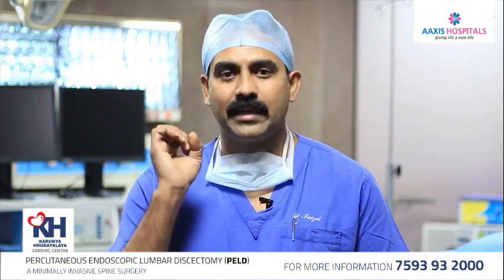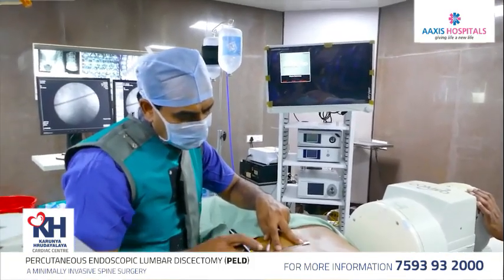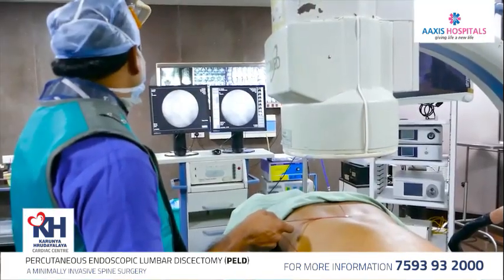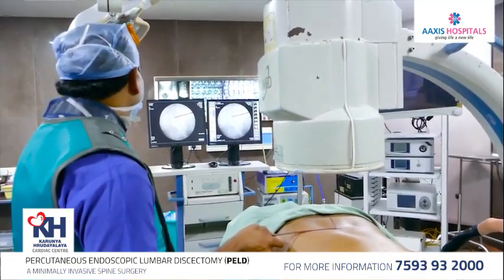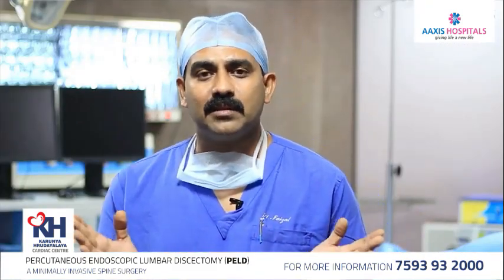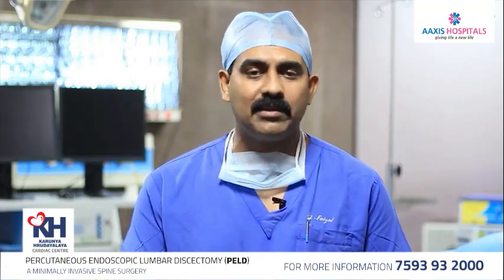So we give a small local anesthesia into the skin, and get into the disc by way of needles, guide wires, cannulas. Once we are in the disc, we confirm that we are dealing with the right disc as confirmed by the MRI or previous examination. We confirm that we are in the disc by giving a small injection of radio-opaque dye. We confirm the position. Then we start the surgery by introducing the scope. The procedure may last from around 45 minutes to 1.5 hours, depending upon what level and what pathology we are dealing with.